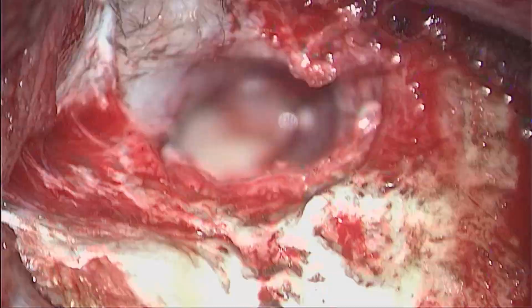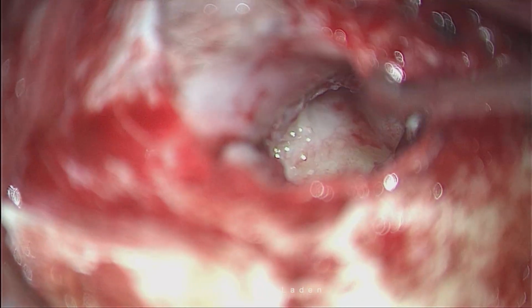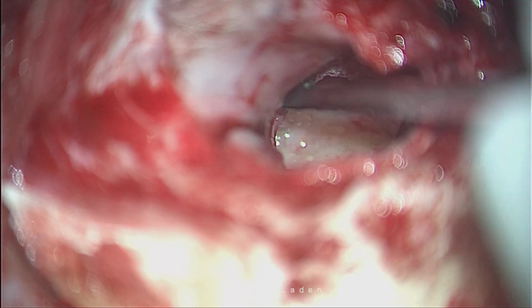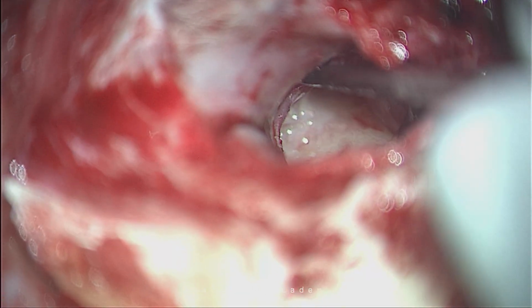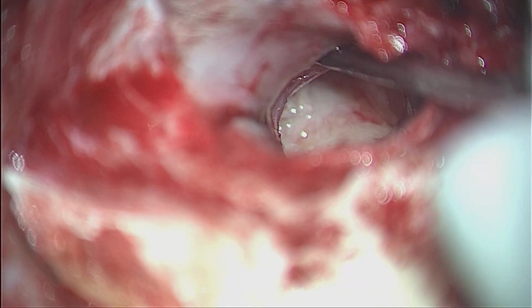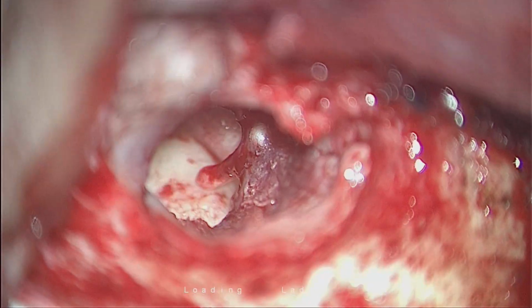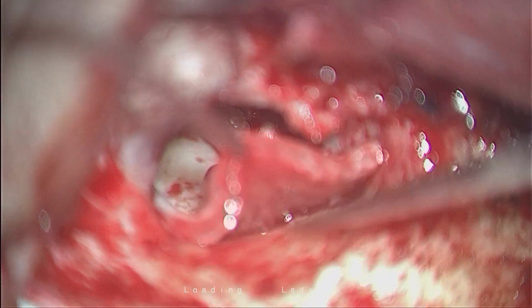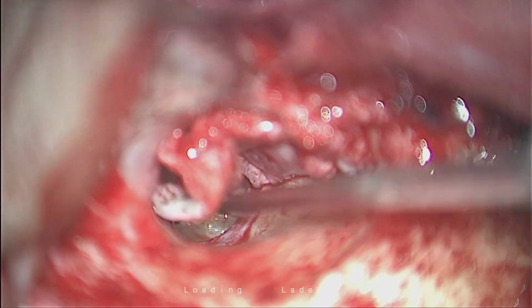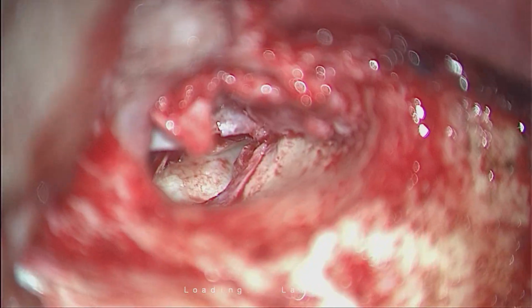And my graft is going to remain in the most physiological position. Physiological means between the mucosa and the epithelial layer. The graft is a fibrous tissue which is supposed to be in between the mucosa and the epithelial layer, and that is where it is going to be. See this? This is the flap elevation part. And now the ossicular chain. Can you see the glimpse of the incus behind?